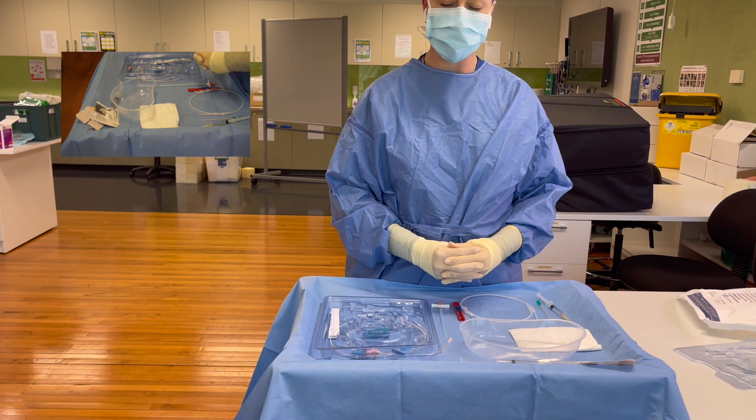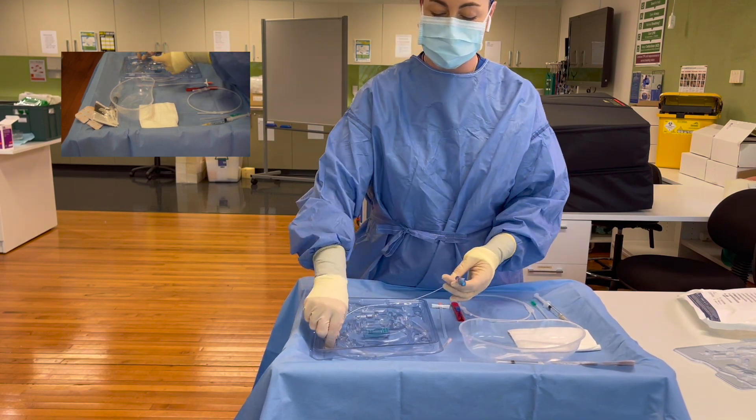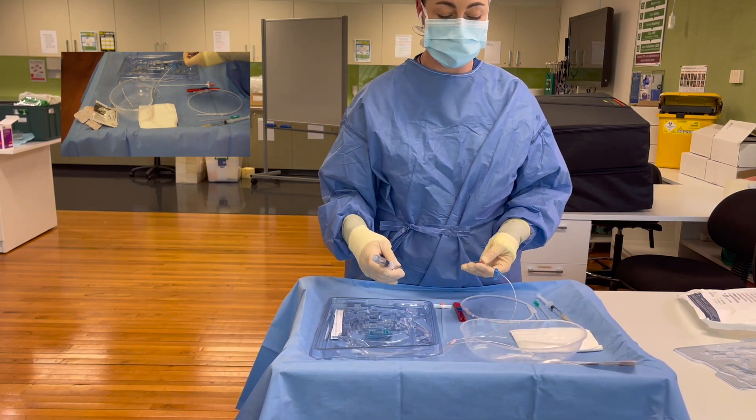This video is going to show you how to flush your catheter when it's in the patient, using the push-pause technique. We're going to pop the PICC line in the little plastic dish just as an example.